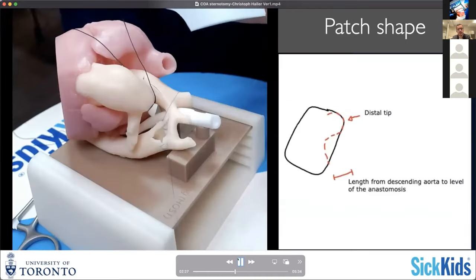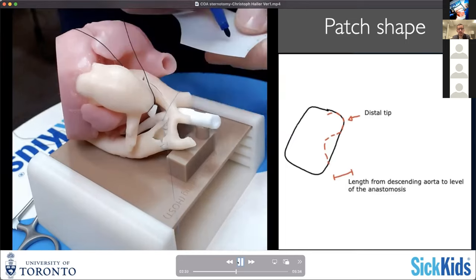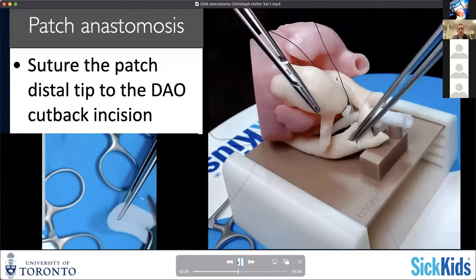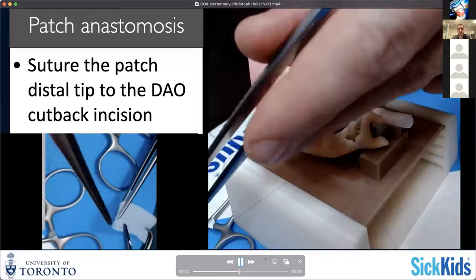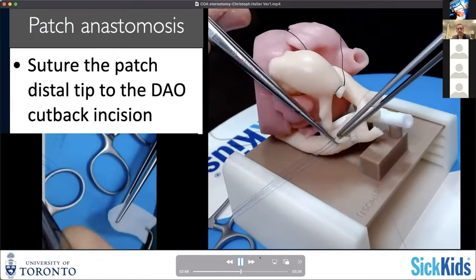It's also a bit of judging how big your anastomosis might be. For me, this distance is usually the distance from my incision in the descending aorta to the level of the posterior wall anastomosis. Then basically at the level where it meets the end of the previously placed suture in the lesser curvature of the arch, you start to have that angle towards the ascending aorta. I have to admit in the model I was not 100% happy with the shape of that patch on the silicone, but you'll see it comes out quite nicely nonetheless.